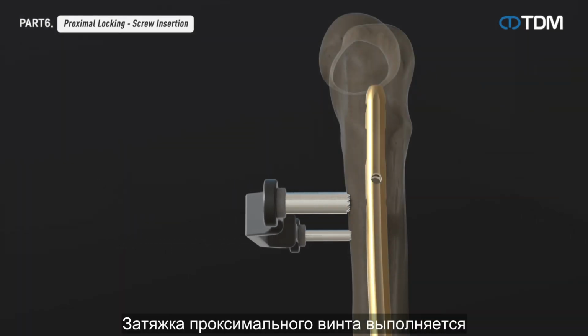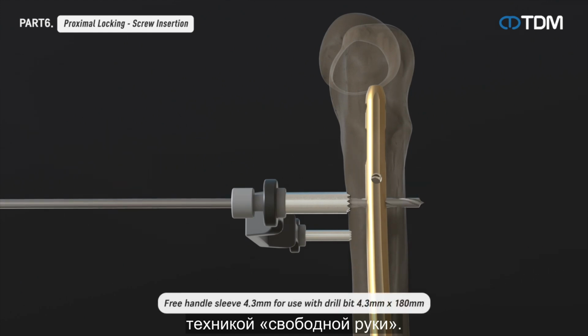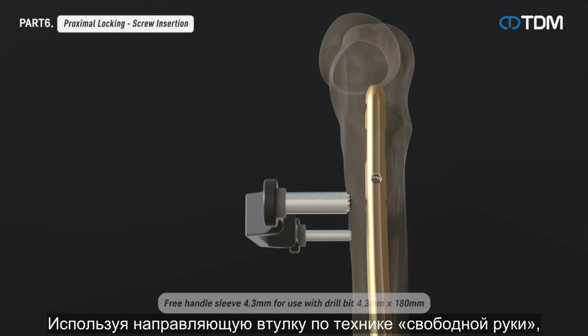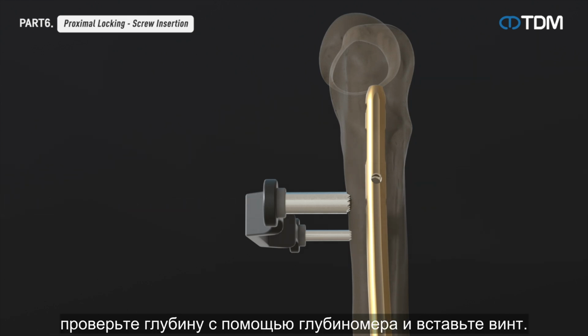The proximal screw tightening is carried out using a freehand technique. Using the freehand drill guide, drill to the center of the screw hole, check the depth with the depth gauge, and insert the screw.